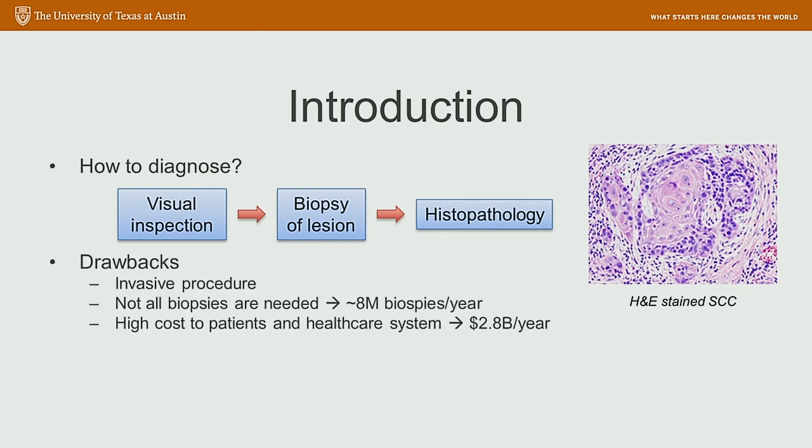There are, however, some drawbacks to the current methods of diagnosis. The first is that the biopsy itself, although it is an outpatient procedure, is a bit invasive, since it does involve a minor surgical procedure. The decision to biopsy is also made by the dermatologist, based on their experience as well as their visual perception of the lesion. As such, not all biopsies may actually be necessary. And this is an important issue when there are 8 million biopsies performed per year.